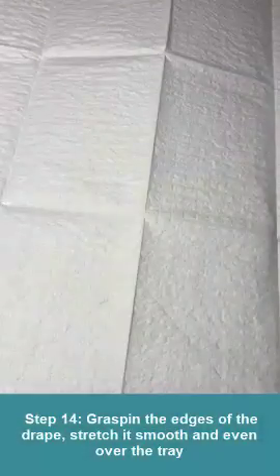So a couple things that I don't want to do is I don't want to brush up against it and I don't want to reach over it. So I'm getting the edges from the ends of the table or surface to stretch it out to get it flat. So I have the drape on the table now.